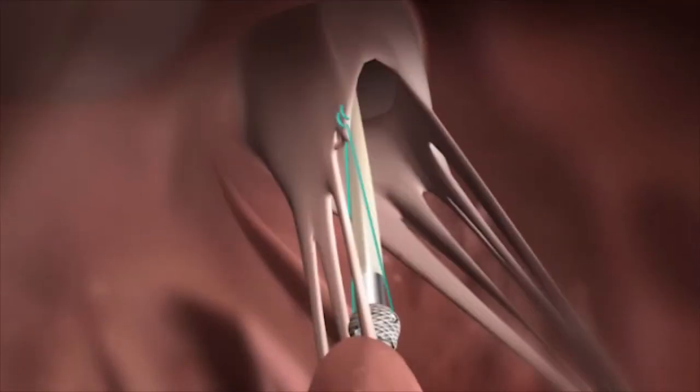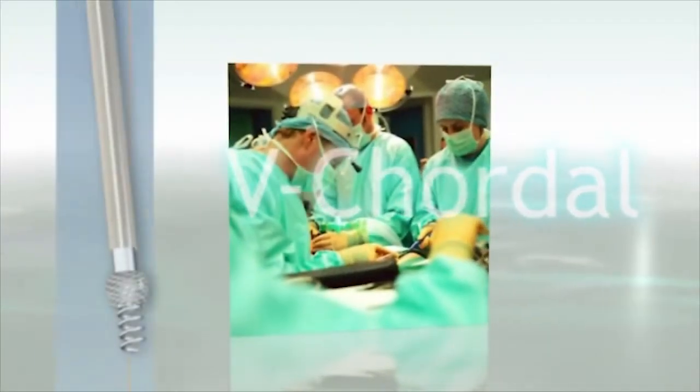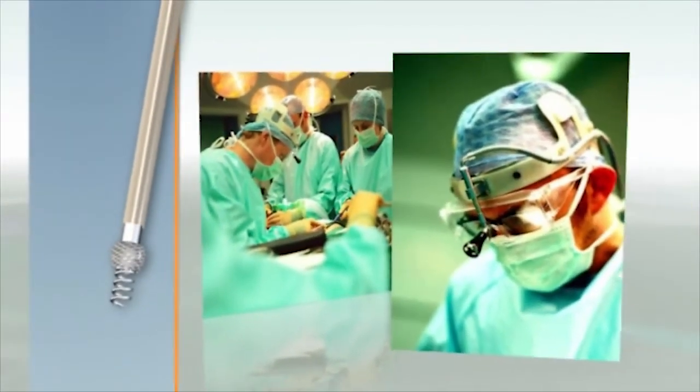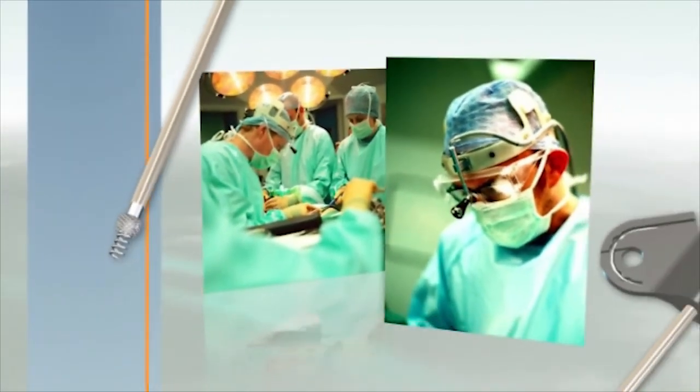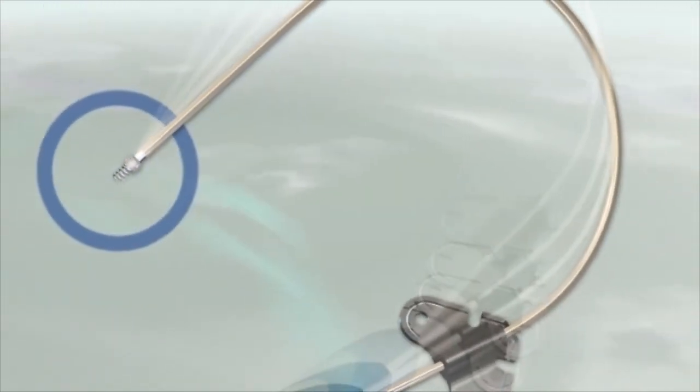Once satisfied, the surgeon disconnects the handle and removes it from the beating heart. V-Chordal changes chord replacement from an art practiced only by highly experienced surgeons to a reproducible procedure, while enabling optimized results.